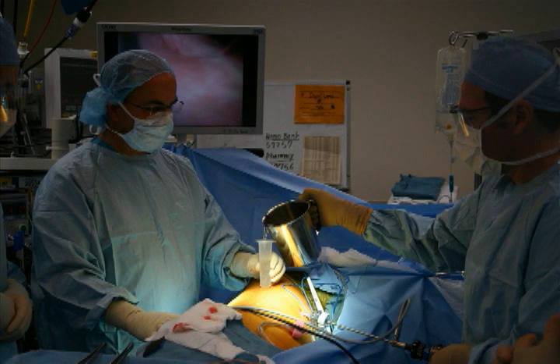The patient is positioned on the operating room table in the left lateral decubitus position. A double lumen endotracheal tube intubation was performed such that the right lung could be deflated. He was maintained on single lung ventilation during the procedure.